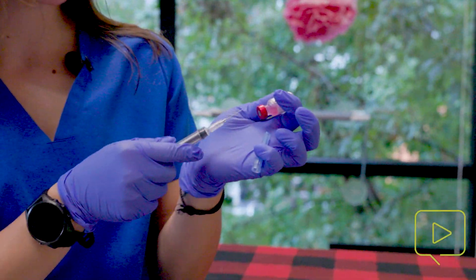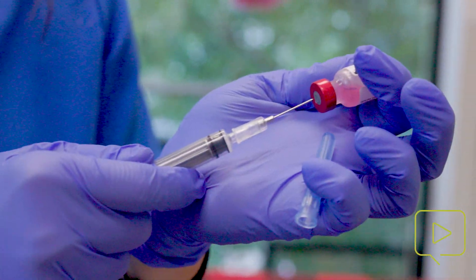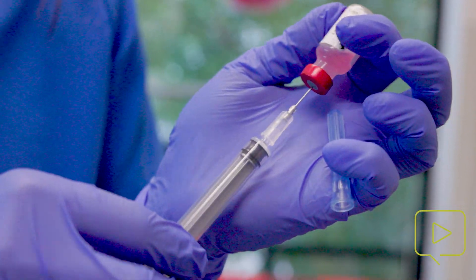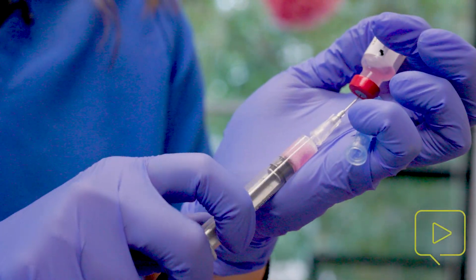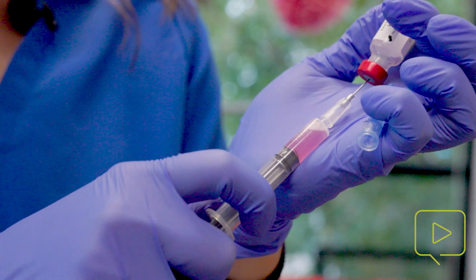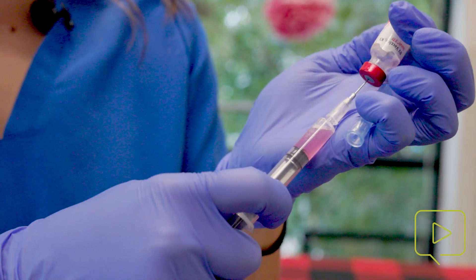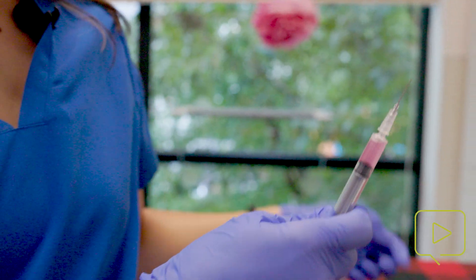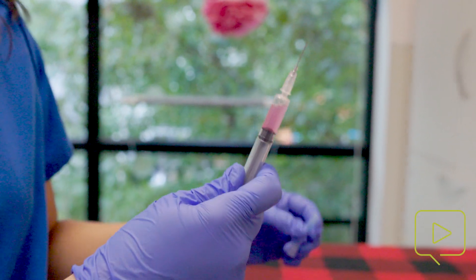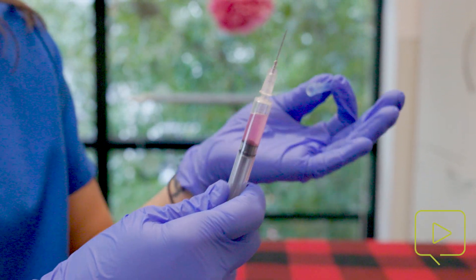You need to puncture the soft part of the vial. I like to keep my needle at the edge so that I can get all of the vaccination. You're going to draw all this back, and then I spin the vial to make sure that I have all of it in here. Once you remove, you'll lose that negative pressure.